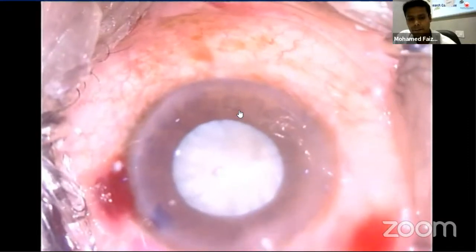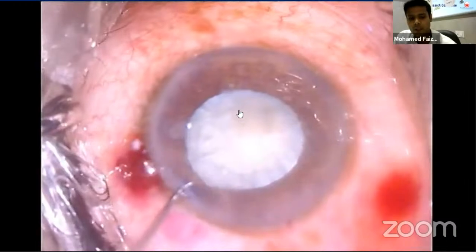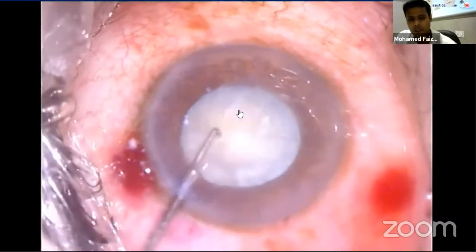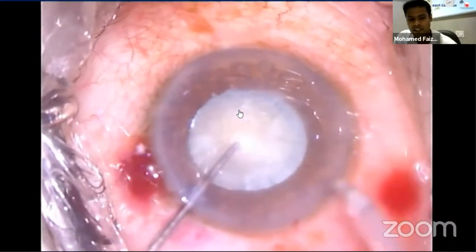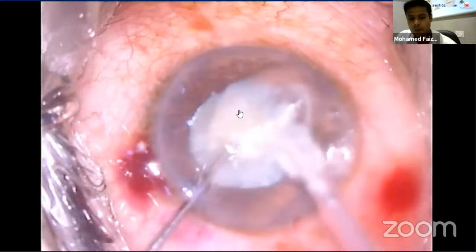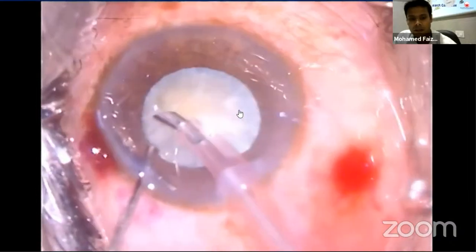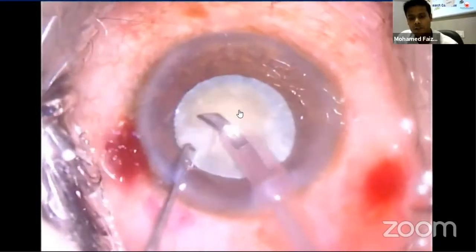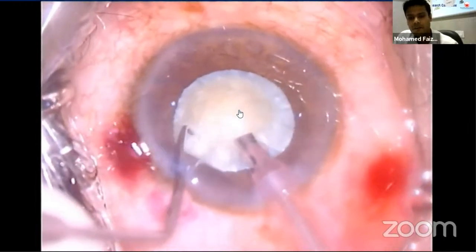Then come the phaco settings. Moderate flow, low vacuum and continuous phaco power are needed. Power used is based on nuclear density. Harder nuclei need higher power, as insufficient power causes the phaco probe to push the nucleus forward, resulting in zonular stress. First, loose cortical fibers and epinucleus overlying the nucleus should be cleared in foot position 2 alone or with minimal application of phaco power.